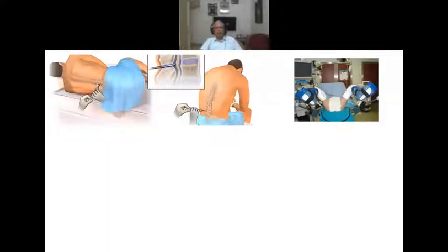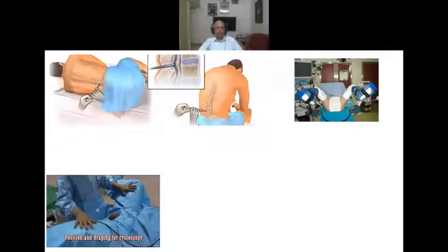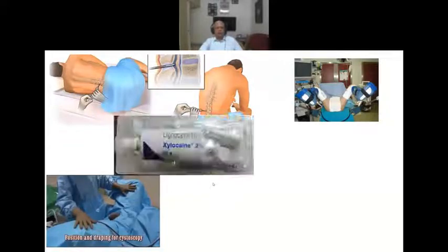After spinal, it is the lithotomy position that you have to give. Ideally, you should have all the head supports and then proper support. And then the third step is to drape the patient and expose the genitals. And the next step is to insert the lignocaine jelly. So what is this part called?